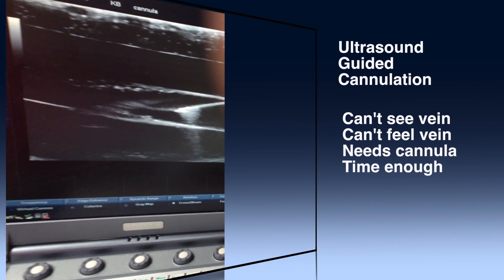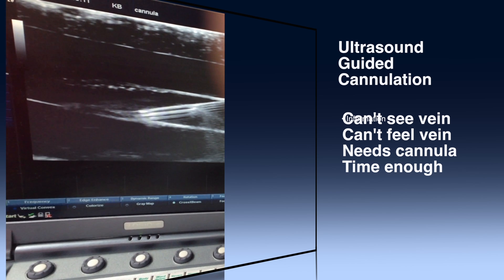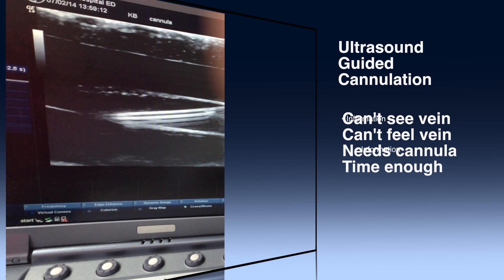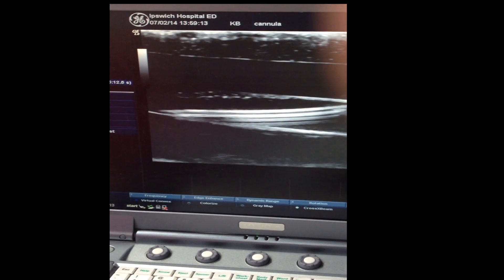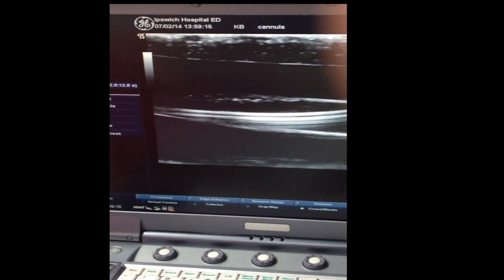Ultrasound guided peripheral cannulation is a great way to learn ultrasound techniques and coordination. However, there are a few tips and tricks that will improve your strike rate considerably.